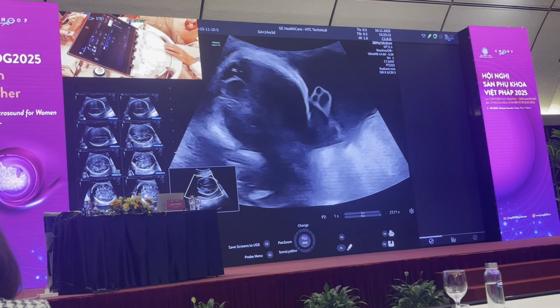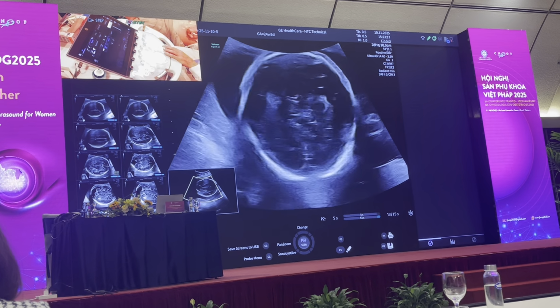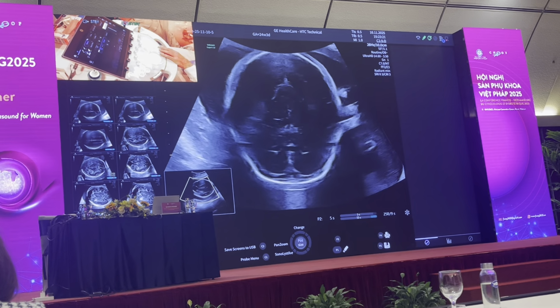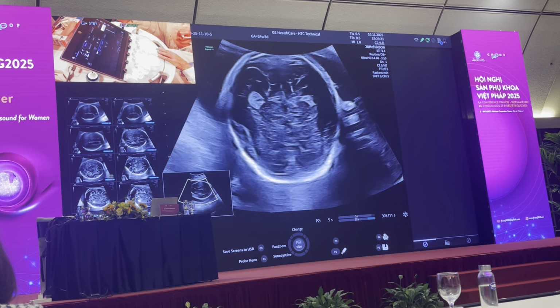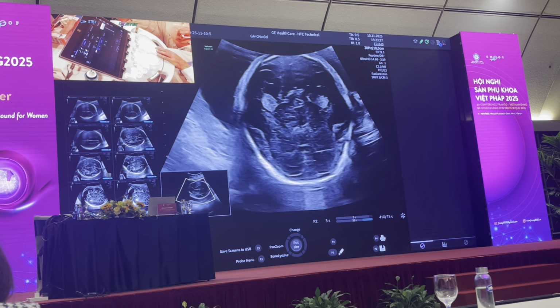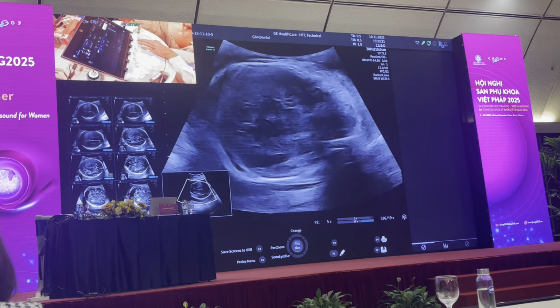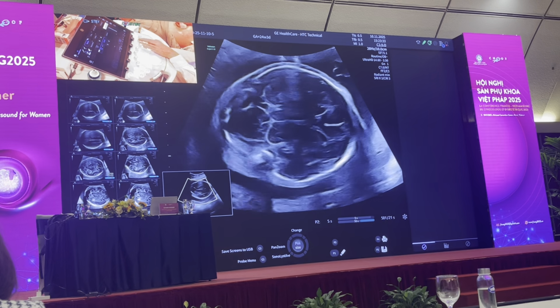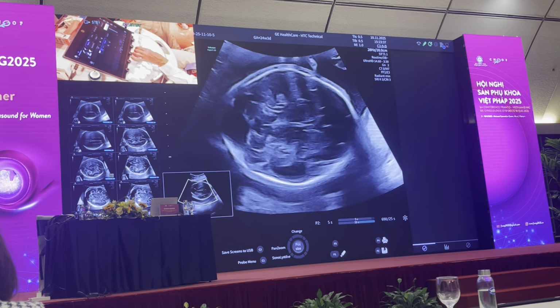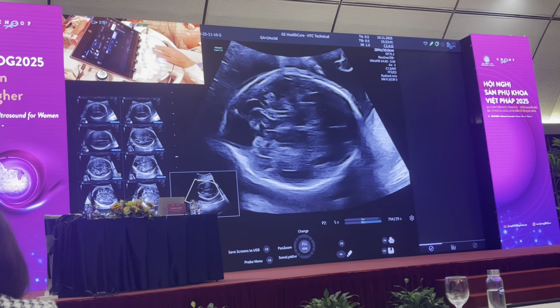With migrational brain disorders, you can either have increased sulcation and gyration, in which you have a large head, or a reduction, in which you present with microcephaly. An important part of the evaluation, which I have not gone into at this stage, is to take a head circumference. But in the interest of time I won't do that, just something you will see. Microcephaly is one of the features of a migration brain disorder.